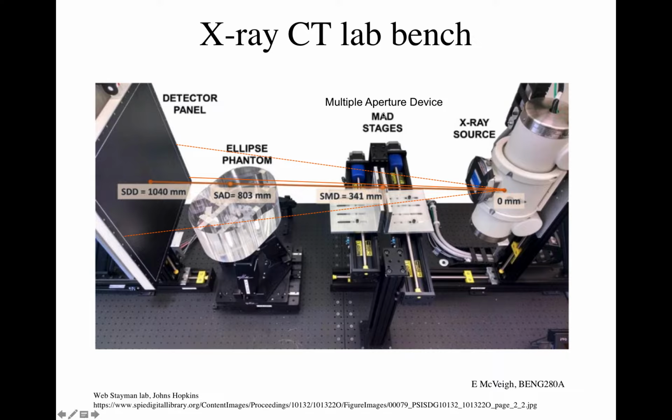Oh, this guy? Yeah. Well, basically it's taking a beam of a certain intensity as a function of space, and then instead of making that uniform intensity as a function of space, if you have some knowledge of the object and I need more X-rays over here than I do over here, it makes sense just to put more X-rays over there and not over here, right? And so it will modulate the X-ray beam if you have some information about what it is you're imaging.